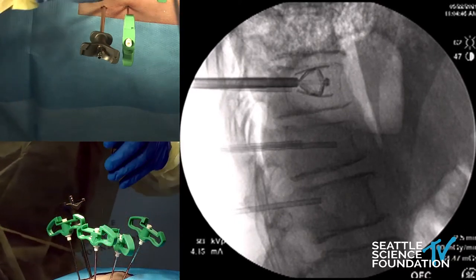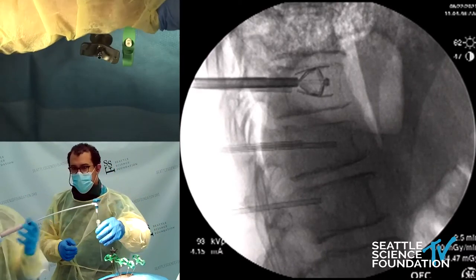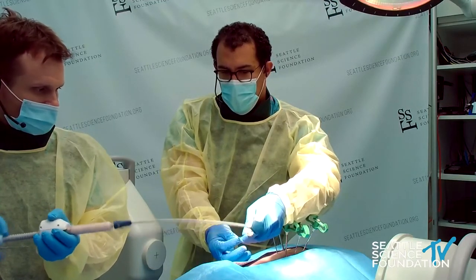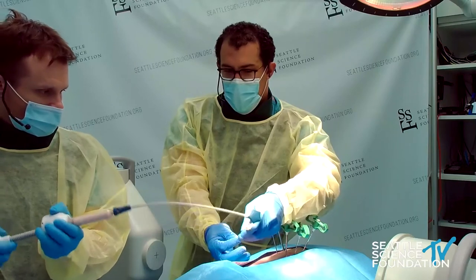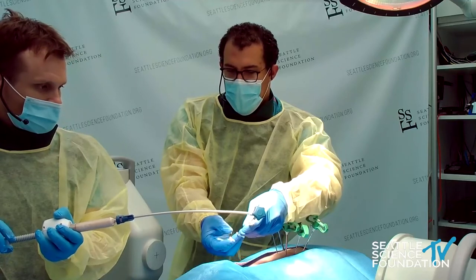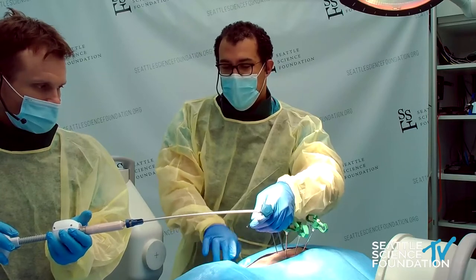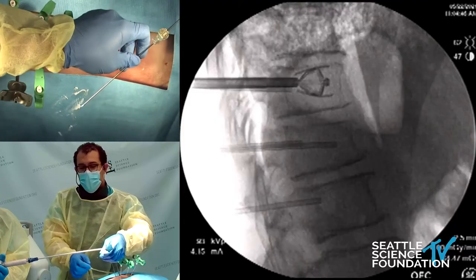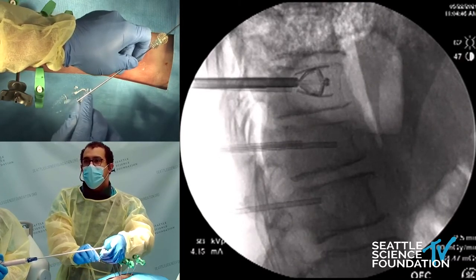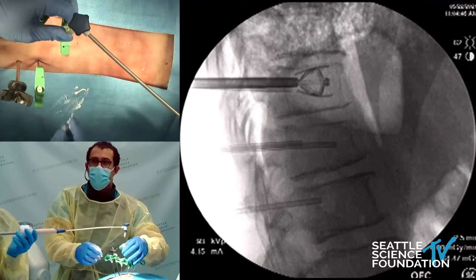We are going to do a more vertebroplasty technique here. We'll check this cement and make sure it's fluid enough. With the vertebroplasty technique, you're not actually making any sort of a void — you're expecting the cement to interdigitate with the cancellous aspect of the bone. This is a totally pure vertebral body; we didn't create any cavity there.